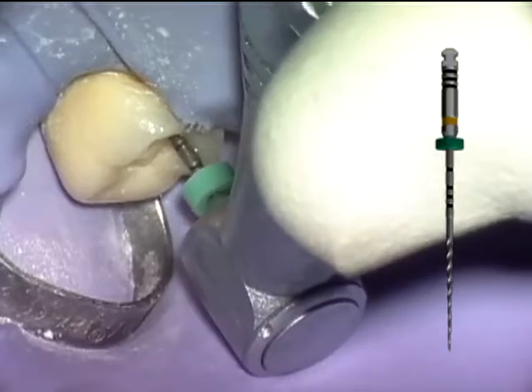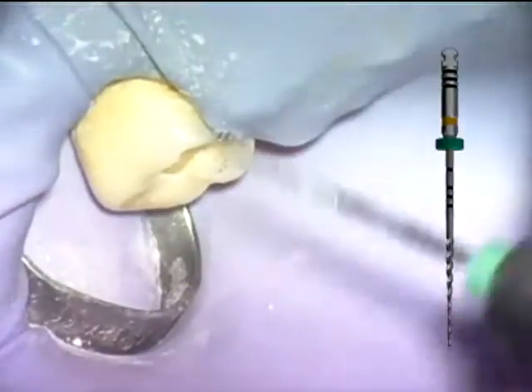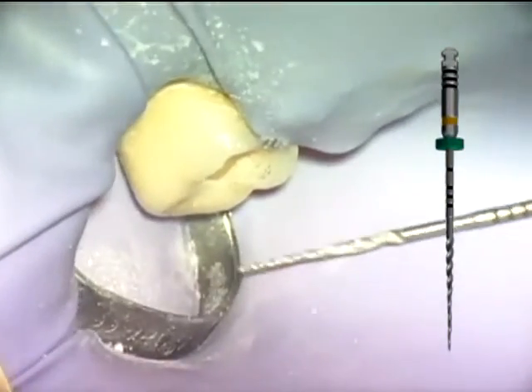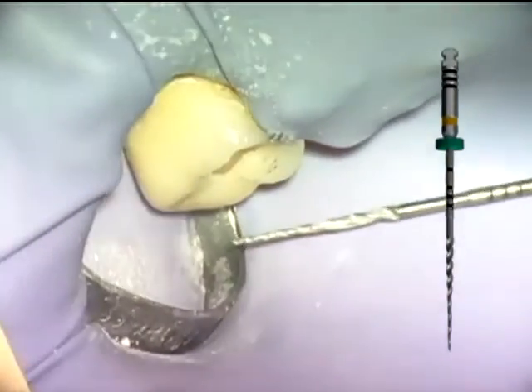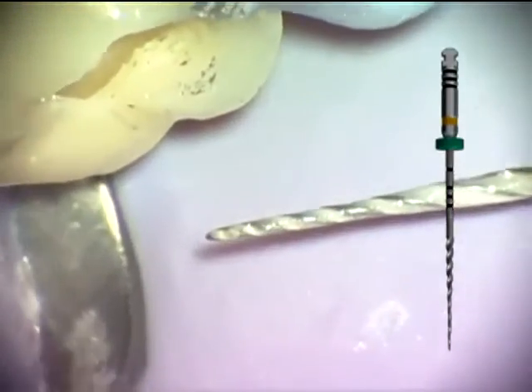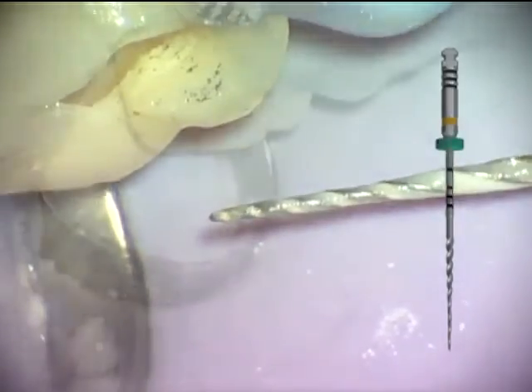The 3006 GTX file is used next, and with a light, even pressure it cuts to length. Close-up examination of the file tip reveals debris packing the tip flutes, therefore indicating, with this visual gauging routine, that the apical shape is sufficient, finishing the preparation of the mesiolingual canal.